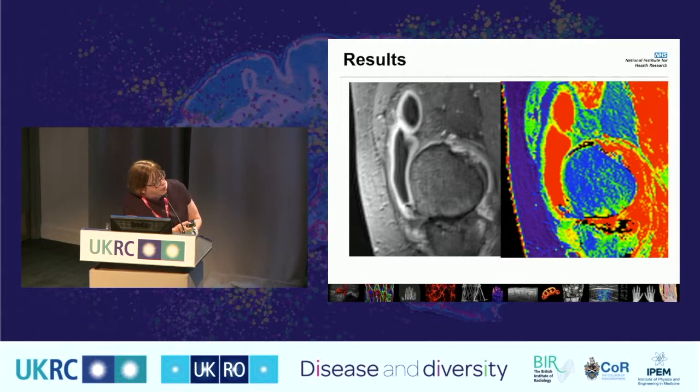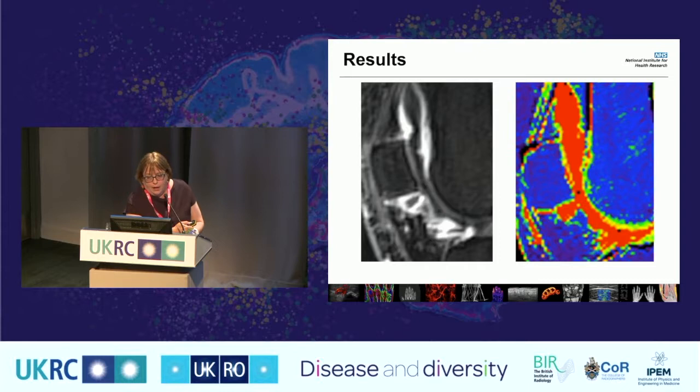So this is my T1 image, and yep, there again we've got the bright red is the synovial fluid. We've got the synovitis showing up around here, and yet we can see that there's some issues happening in the femur and the tibia as well, because the bone marrow, which should be this blue signal because it's fat, has actually been disrupted completely, and we've actually lost all the cortical bone both in the femur, and we've lost cortical bone in the tibia as well. And surprisingly, we can see things on T1 that we kind of thought, well, what's happening on the post-contrast images?